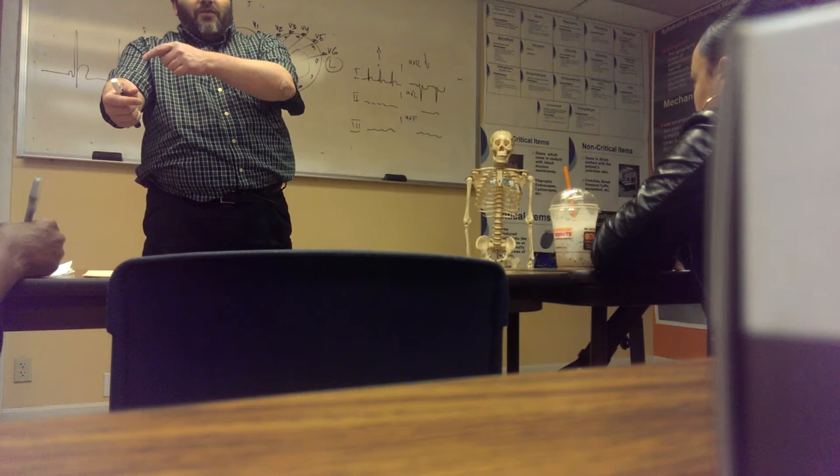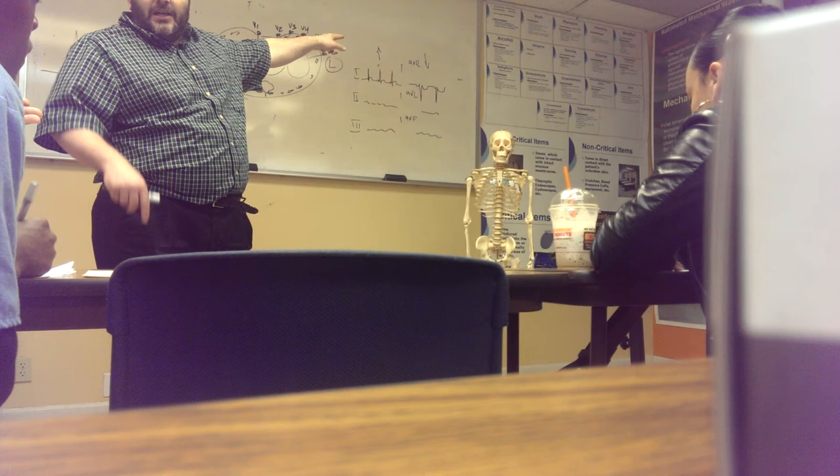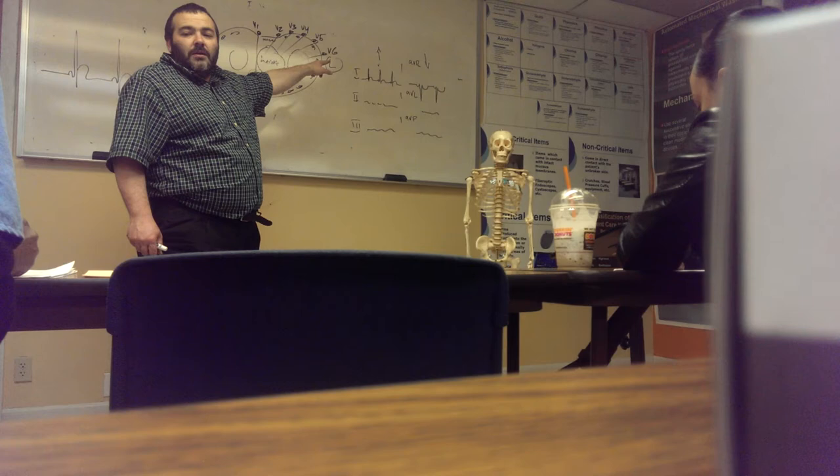So if it's reversed. AVR is supposed to go where? There's an arrow next to AVR. Where does the arrow point? That's right. So AVR must always point down. And where does lead one have to point? Up. Lead one has to point up. That's right. There you go.